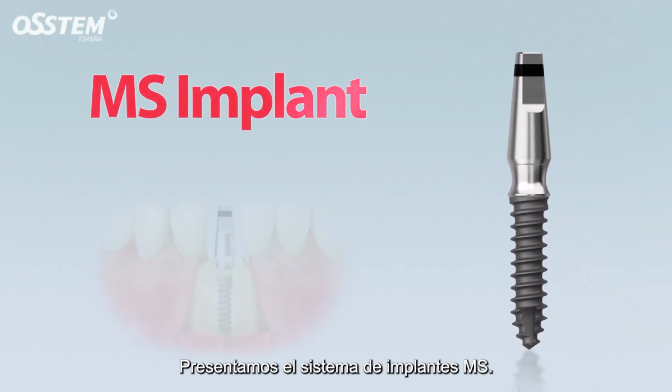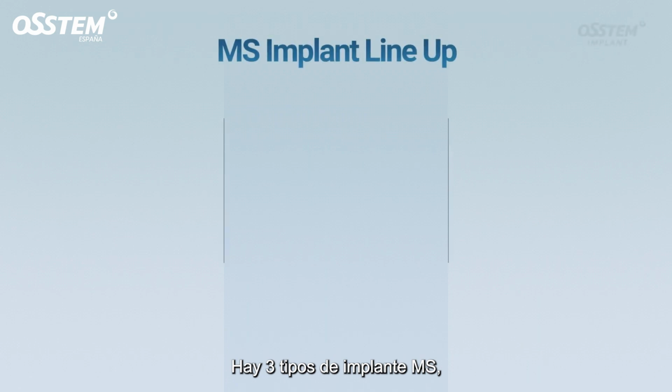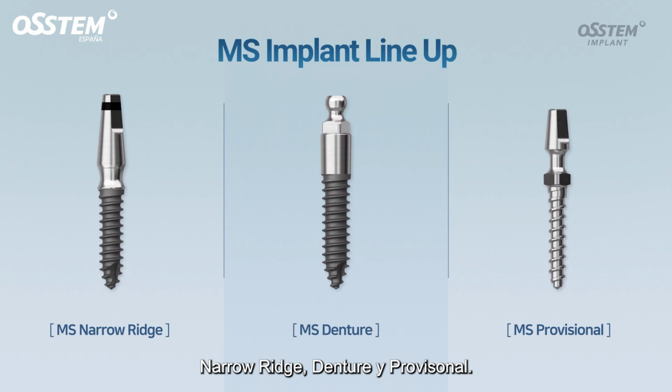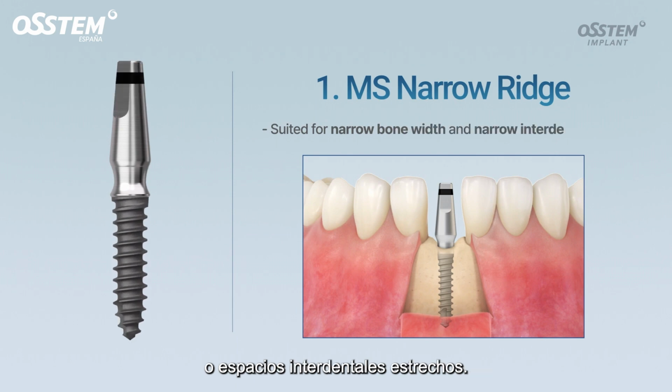MS Implant. Introducing the MS Implant, the one body type implant for narrow bone width areas such as the mandibular anterior region. There are three types of MS implant: narrow ridge, denture, and provisional. First, the narrow ridge is a one body type implant suitable for areas with narrow bone width or narrow interdental spaces.